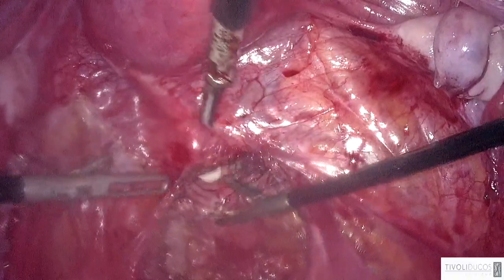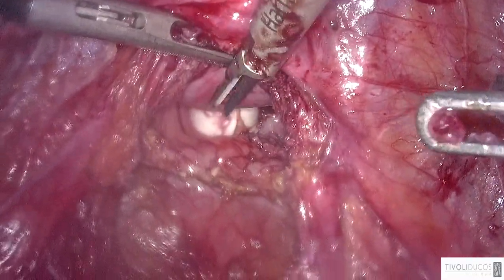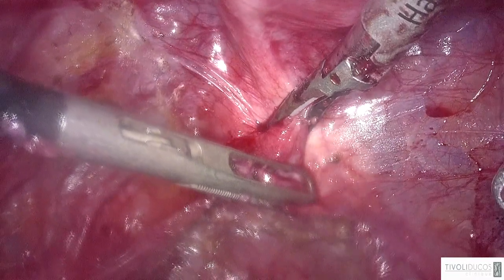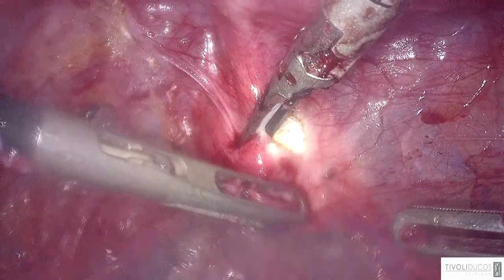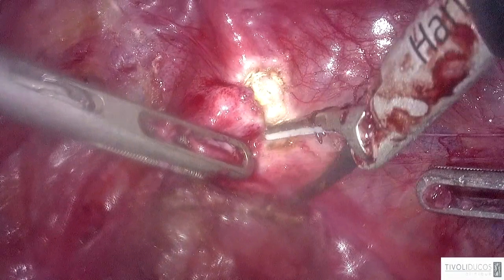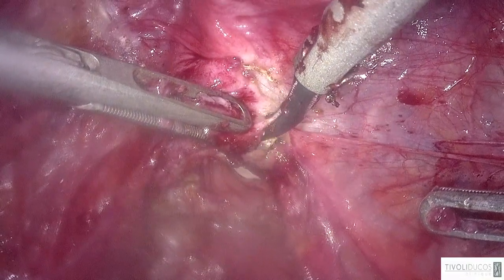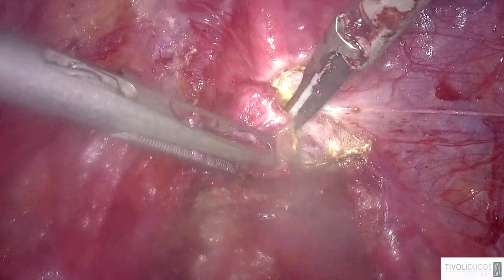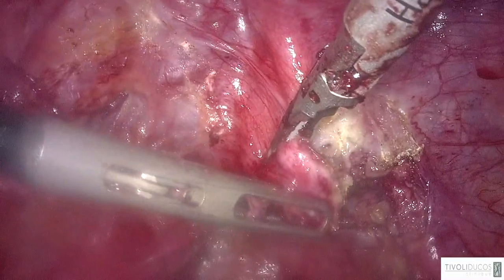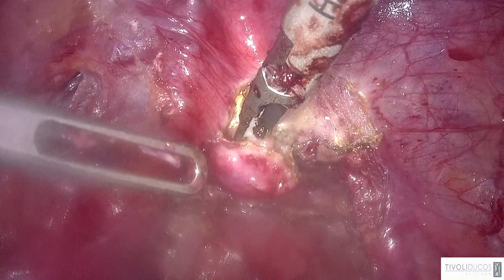Okay. So now let it down. So the cervix is here. The cervix is here. It means that it is an abnormal tissue. I think it's what we are calling the nodule of the torus, uterine torus. So in fact, it is rather adenomyosis, and I will cut it gently and not dig too much in order to avoid rendering the cervix fragile, because the patient is nullipara and she intends to have children later.